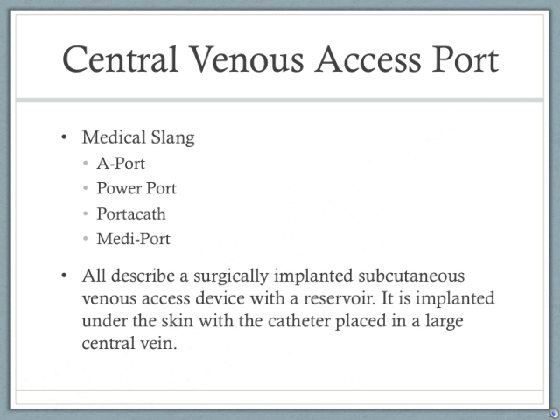Either way, all these terms describe a surgically implanted subcutaneous venous access device with a reservoir. It is implanted under the skin with the catheter placed in a large central vein.